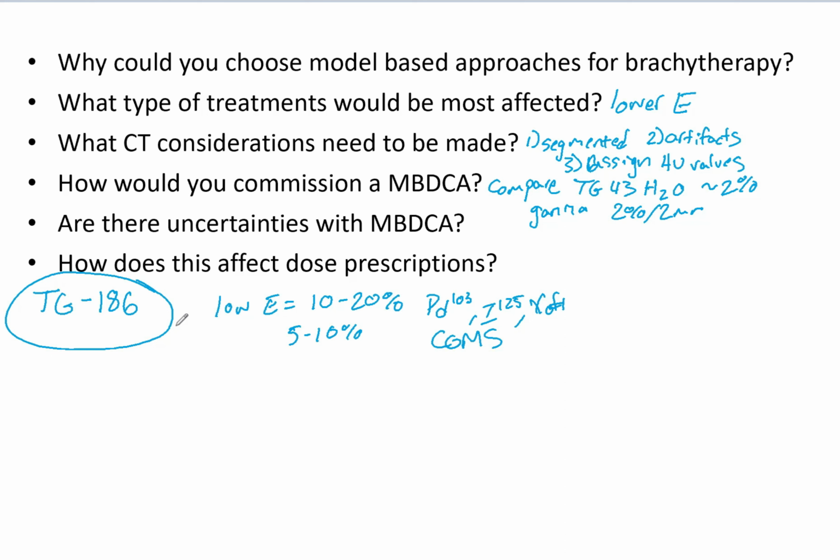And then to talk about the uncertainties in this, first of all, you have a trade off in time versus accuracy. So, obviously, potentially, I should say, the more accurate, the longer it's going to take, similar to Monte Carlo. And sometimes you don't have hours to wait for a dose calculation to actually calculate. So, you have a trade off. There also, you may not be able to have a voxel size smaller than 2 millimeters cubed. And then there's limitations at which applicators you can use potentially as well with model based approach. So, all things you want to consider.